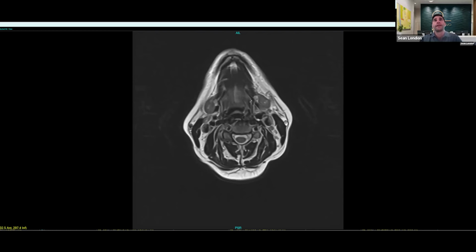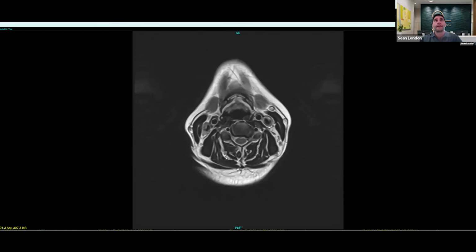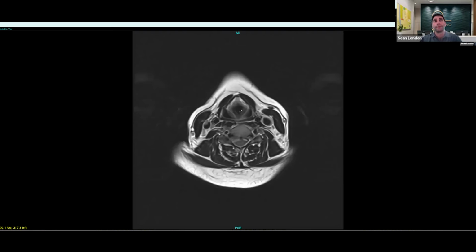As I come further down, I'm looking at the neck soft tissues, looking for any abnormally enlarged lymph nodes. I don't see any. These all look like physiologic lymph nodes that we're supposed to have. Here's an example of a normal appearing lymph node right here. It kind of looks like a bean or a curved backward C there. That's how they should look. Our lymph nodes generally respond and can get enlarged at times of infection, but can also be pathologic and become enlarged due to cancers as well. So that's why we look at them throughout the whole body. I don't see anything concerning here.